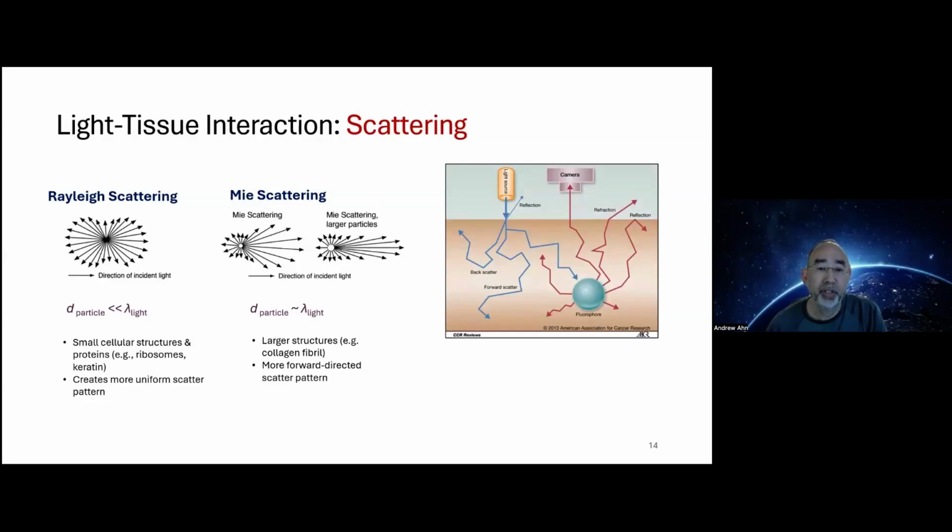As a result of these two processes, you have an almost Brownian, path-like motion of light, as shown here. And this accounts for why the path of light traveling from the source to the detector has a banana-shaped pattern after averaging over many photon paths. And we will come back to why this is important.